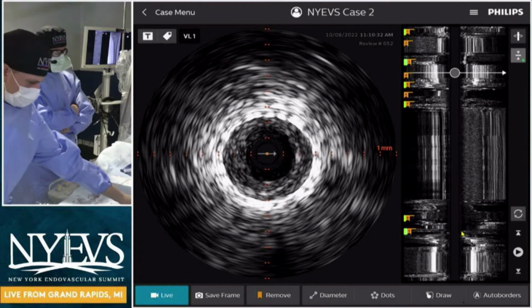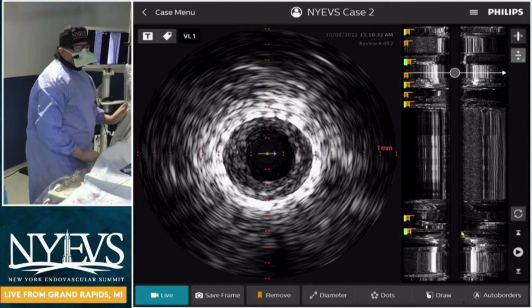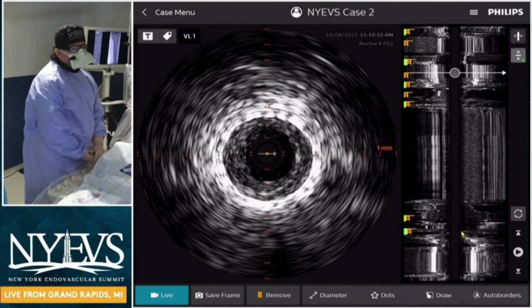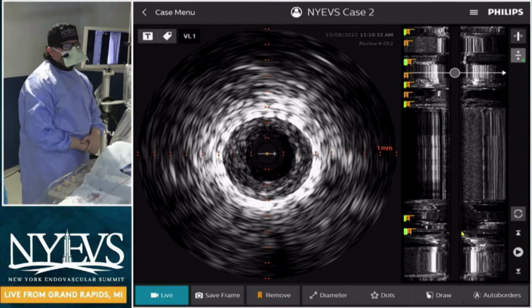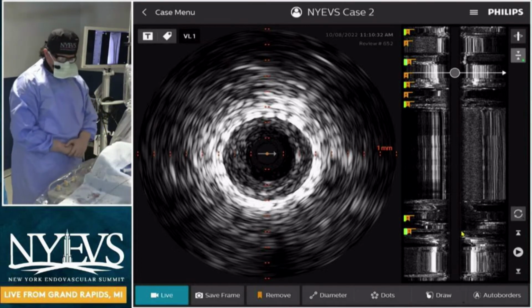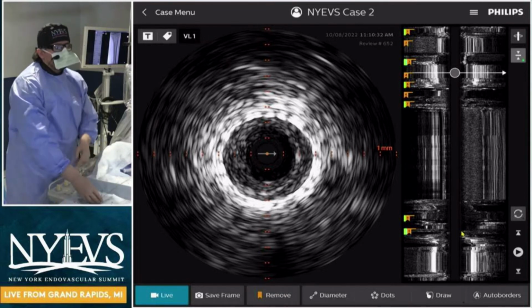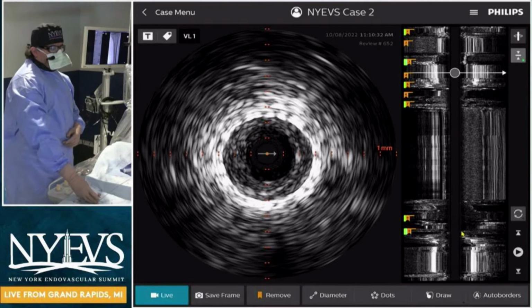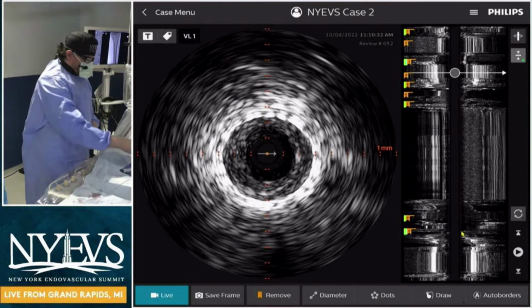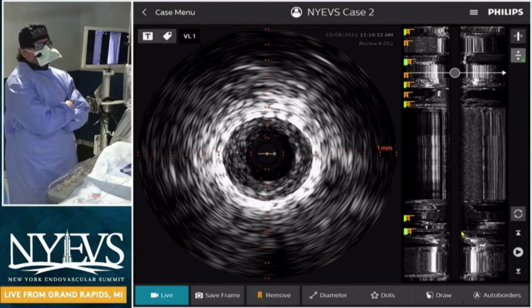Fadi, I agree. Your Navicross was occlusive. So we know that even with a 1.7 on the highest settings, is it going to have the same effect as a 2 millimeter? No. However, a 1.7 is going to modify that plaque and should do some modification, especially as you're closer to the. Well, I agree with you because it is a form of vessel prep, but the question is, are we prepping enough? And I think Fadi's balloon angioplasty results showed that we were able to get enough of a lumen at the end, until we do another IVUS to see what's going on.